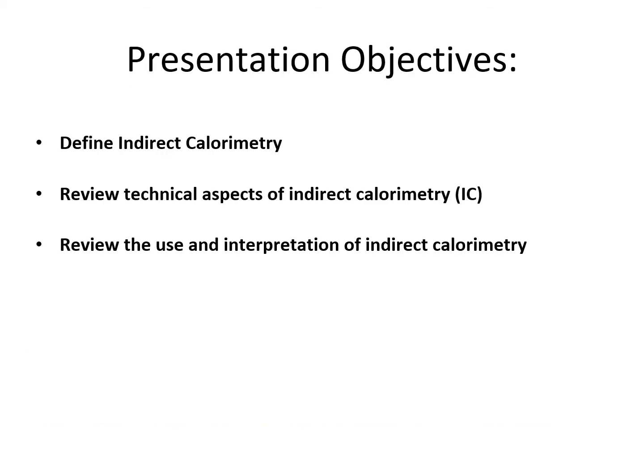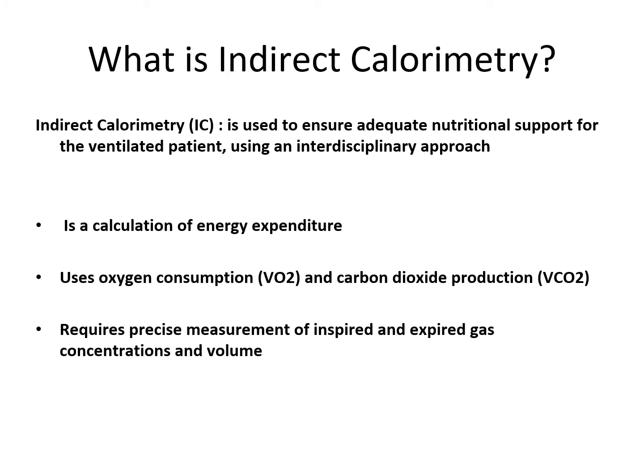Okay, so indirect calorimetry. I'm going to be talking about why we use it and how it's interpreted. These are just the objectives. We look at indirect calorimetry to make sure that our patient is having the proper nutritional support, especially when they're on a ventilator.